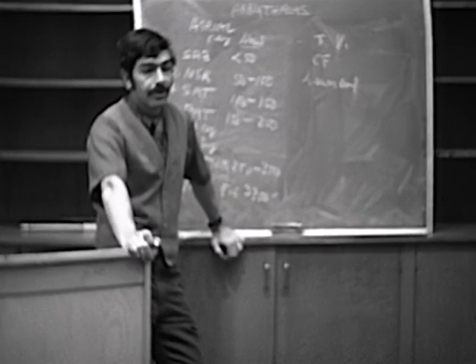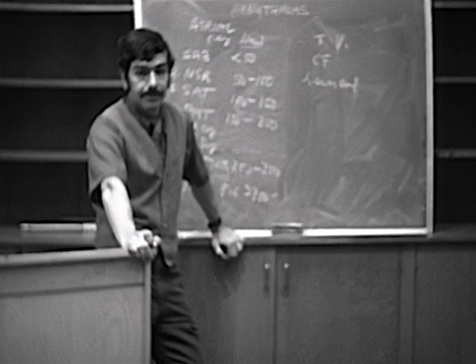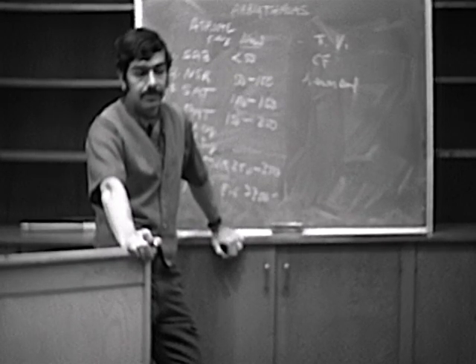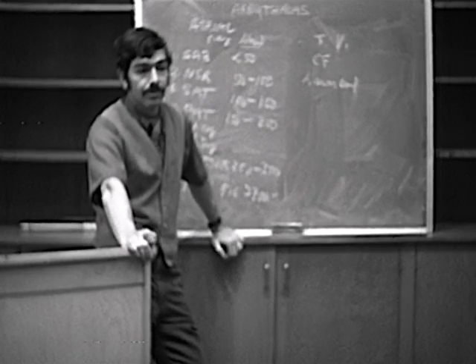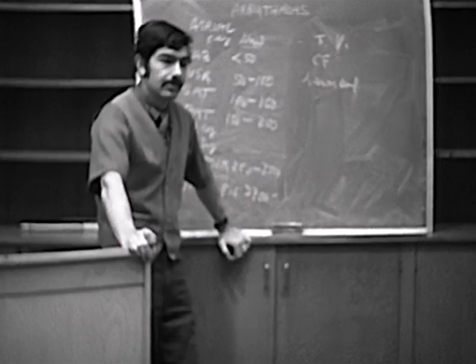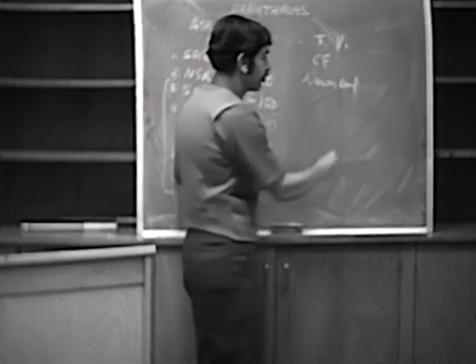Now, there are some more things that you can do, right, such as what? What other kind of maneuvers can you do in order to look at P waves? Right. Esophageal leads.